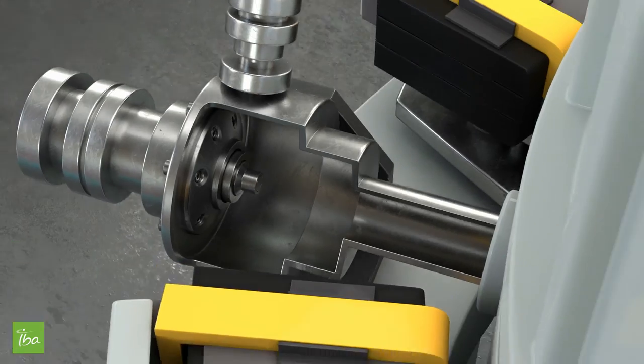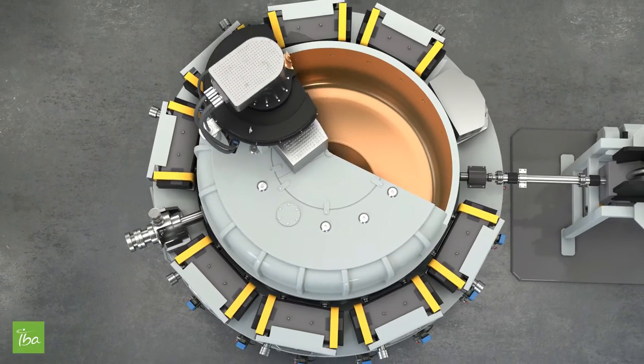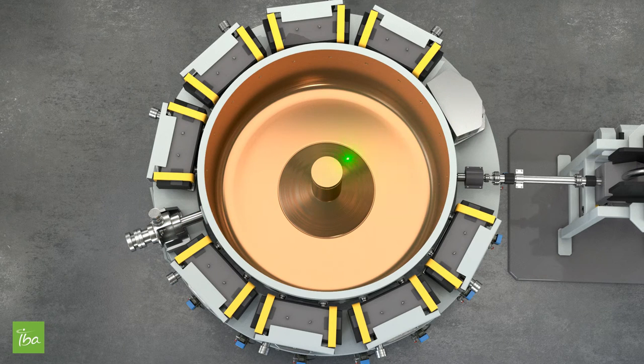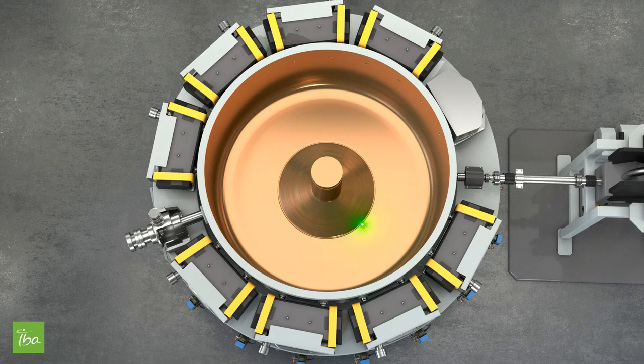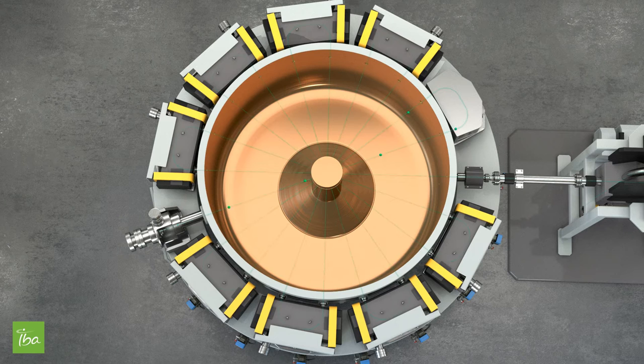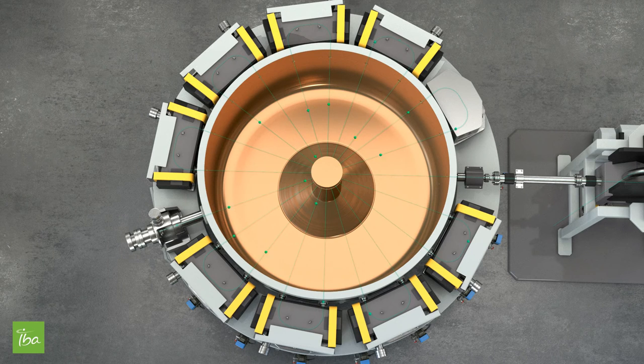When electrons reach the inside of the cavity, the RF system produces an electric field between the external wall of the cavity and the central pillar. The electrons are therefore attracted by the pillar. When going through it, the polarity of the electric field is reversed in such a way that when traveling in the second part of the cavity, the electrons are accelerated a second time.